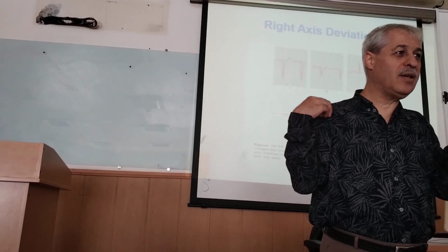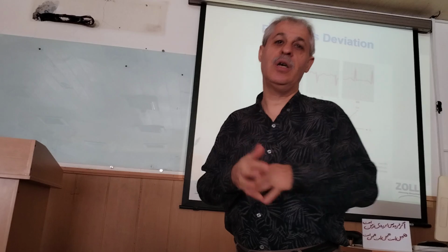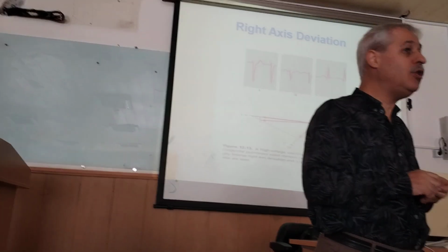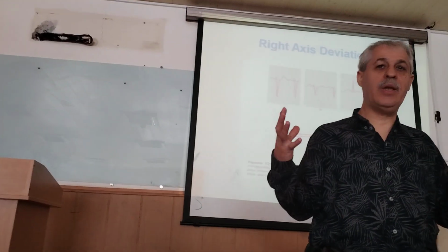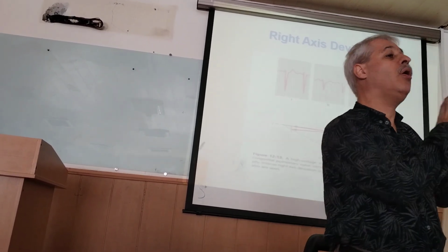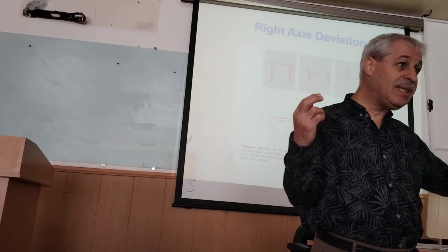These are unipolar limb leads for right hand, left hand, and left leg. Right leg in normal electrocardiography is a neutral or ground limb. So if we connect the electrodes of right hand, left hand, and left leg, plus right leg, to a high resistance source as the negative pole of the electrocardiograph apparatus, we make them zero.